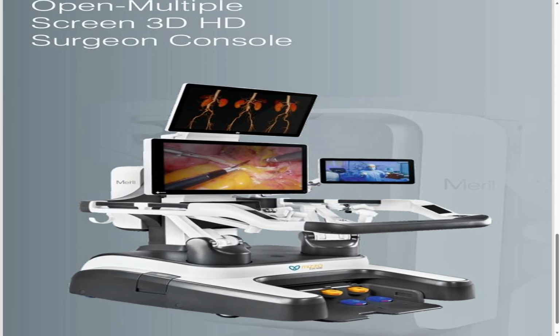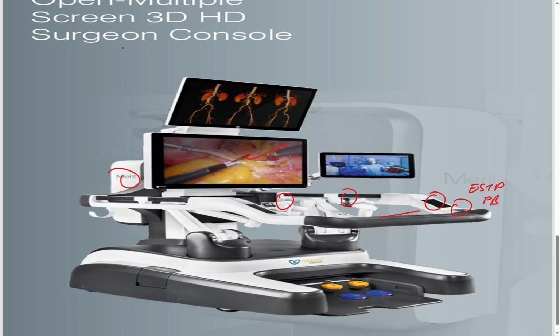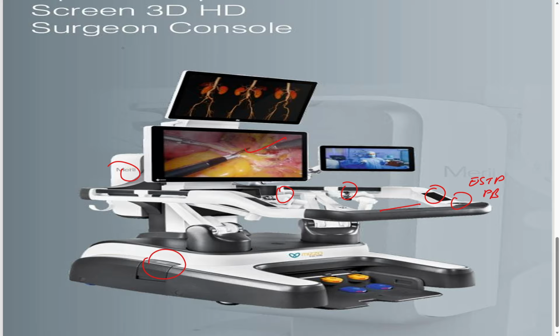Again, this one I think is from Meril. Meril also has a 3D monitor and this hand controller. This is for the surgeon profile, and here you will see this is for the e-stop. The power button will be there, and this is the hand rest. And this is a brake. If you see, this is the brake, and then the foot pedal will be there. Their foot pedal is the same as the da Vinci foot pedal. And then this hand rest will be there.